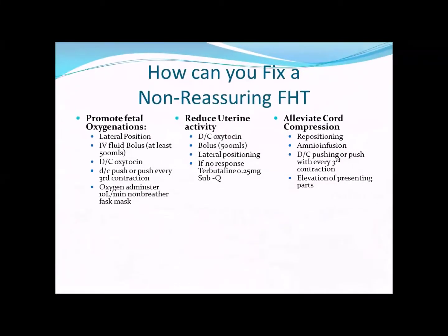So how do we fix it? Because that's what we do. We fix things. If you look at this, there are 3 main things that we nurses do while we're calling the physicians. We flip them, we turn off their pit, and we turn oxygen on, and then sometimes we'll bolus them as well. So if we're thinking that the baby's having some lates, and so we're thinking that the hypoxia is there, we're going to lay mom on her side.